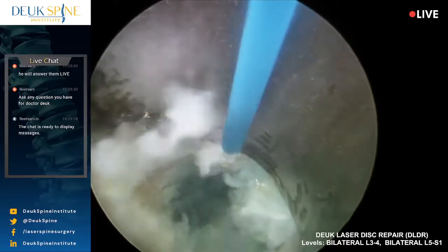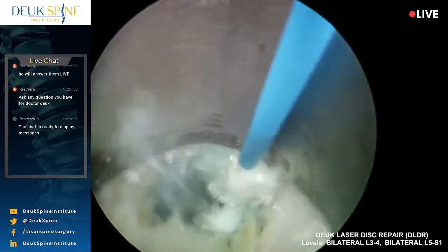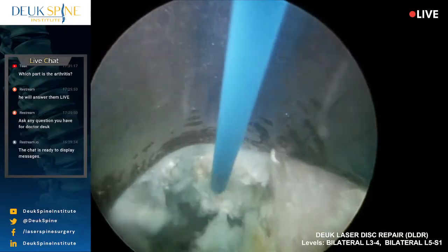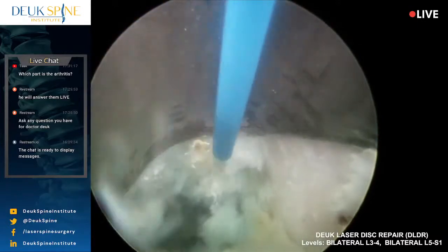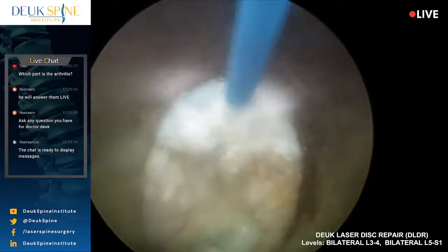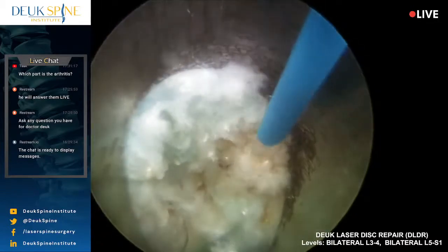And the last disc, if you remember, was kind of soft and billowy. This stuff here is just a lot of scar tissue from long time injury, really old injury. This is the 9-year-old injury right here, this disc. And look at all that, just so chunky and thick. As opposed to that last one that just melted away like butter. This one is a lot harder to get rid of.